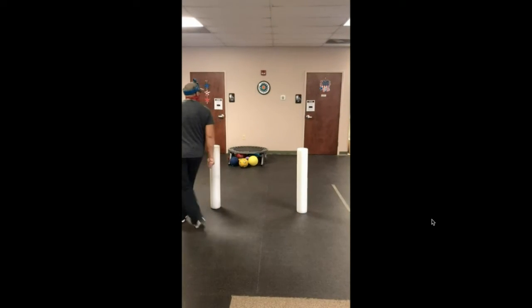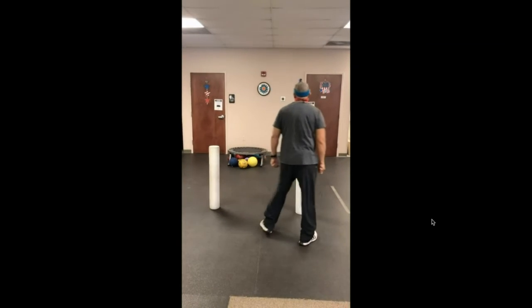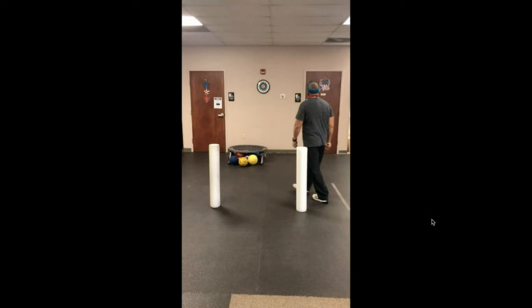So this can really add a lot of value, especially videotaping these and then going back over those later as a clinician, or going over them with the patient in real time about why we are working on what we're working on. You can see these in real time as a clinician. You can see them in real time as a patient, but also having a video log, if they'll allow you to do that, to show your progress over time. You might be able to save these still clips or videos into their patient file, depending on what sort of software you use. They can add extras even on the documentation side for what you're working on.